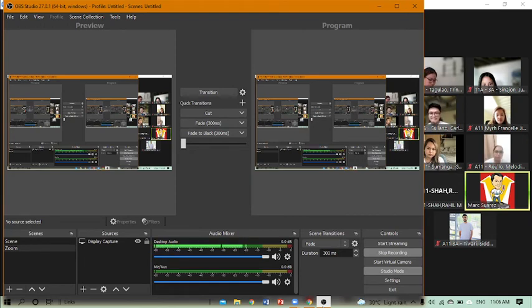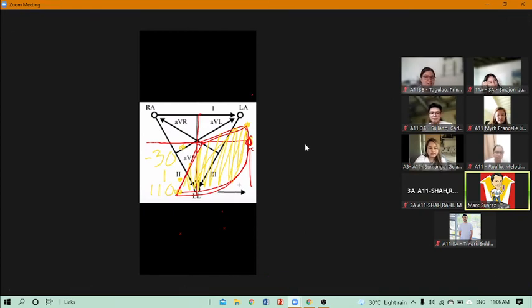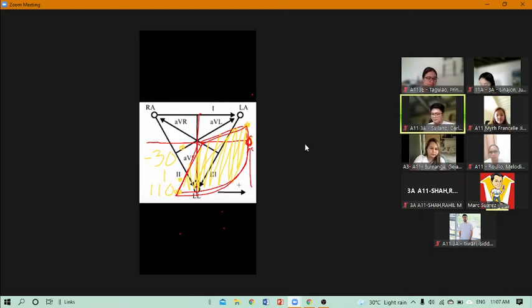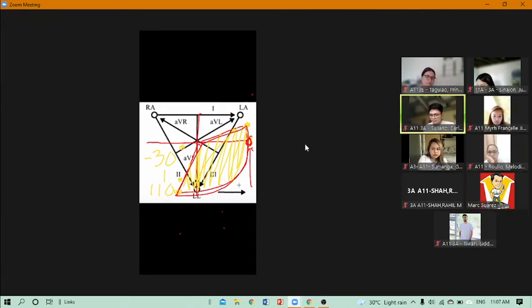Okay, I'm sorry. Where were we? On the normal axis, Doc. Okay, normal axis. Let's say the axis is exactly 0. Is that normal or abnormal? Normal. Okay? Let's say you were able to determine the axis at plus 50. Is this normal or not normal? Normal. So you understand now?